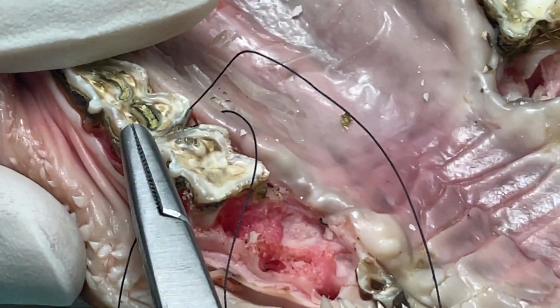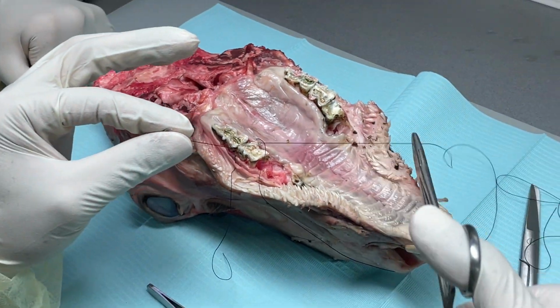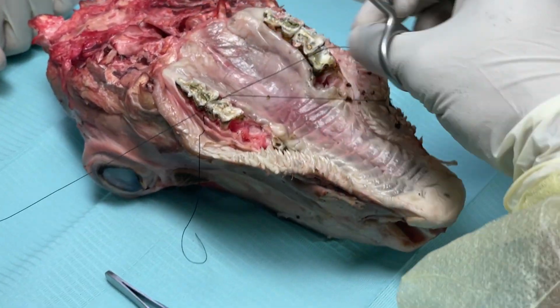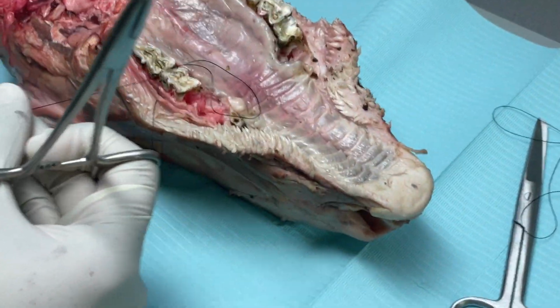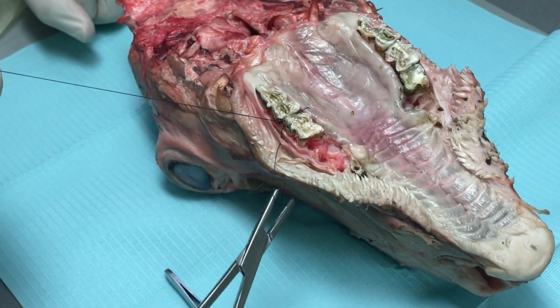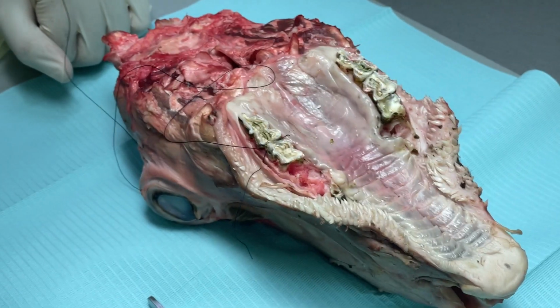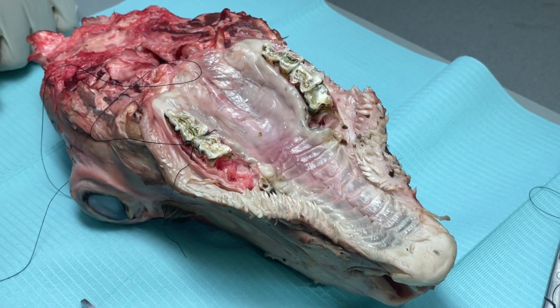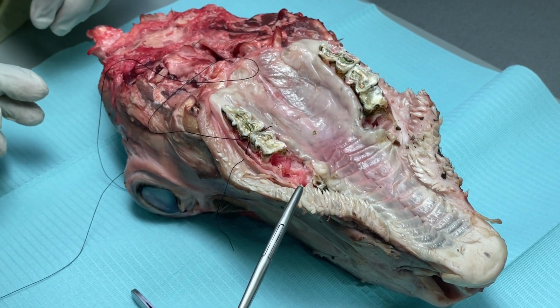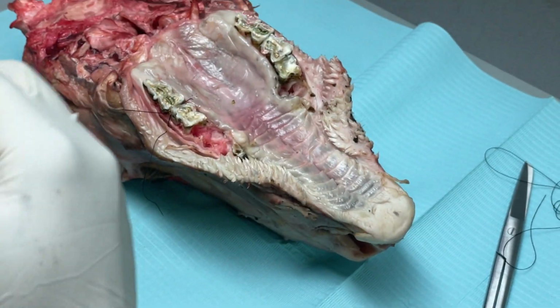Clear? Always try to keep minimal length here on the free end. Why? If you have more length here and then you tie the knot, you are wasting a lot of length. If it is just for one suture, okay, but if you have to do multiple sutures, you will end up wasting the length. So try to preserve the length on this.